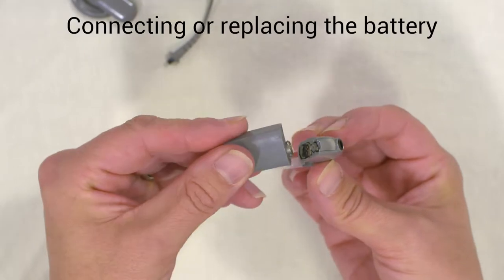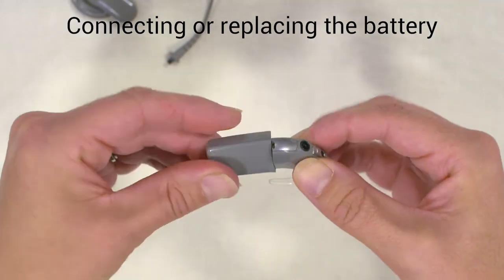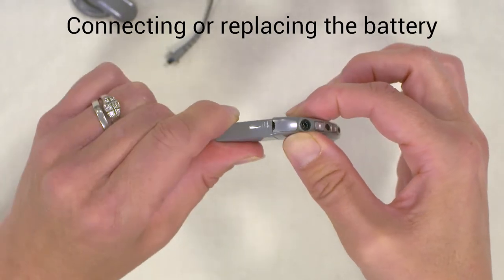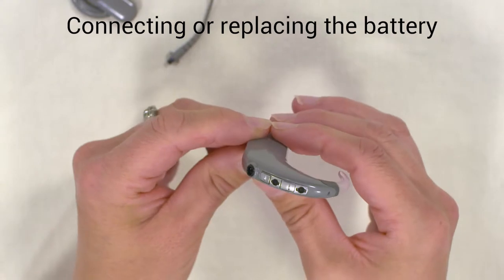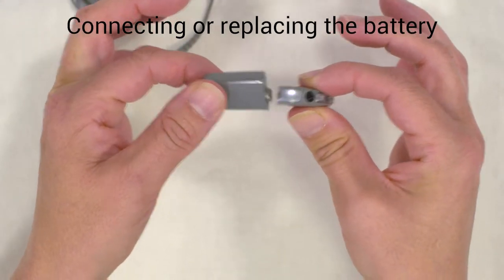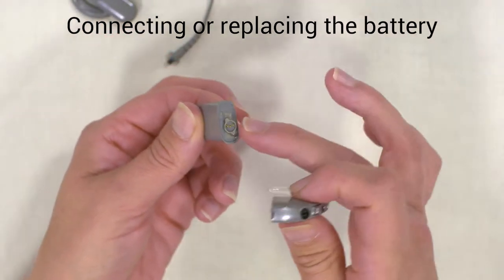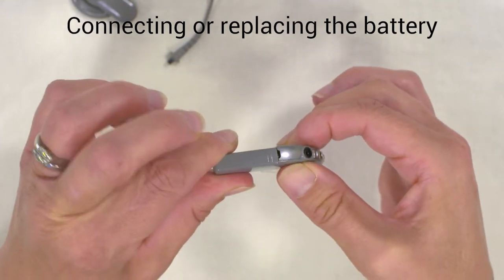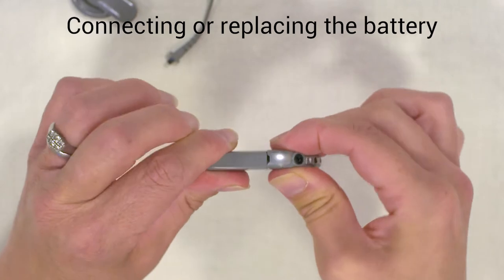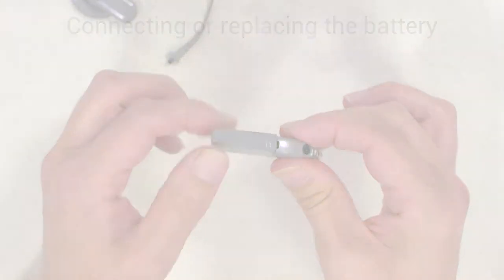The battery connects via a bevel. It sits on at an angle and then you twist it to attach it. To take it off, twist and it comes apart. This is quite a durable connection but you do need to make sure that it's tightly on — if it's slightly undone, then you could have a problem.